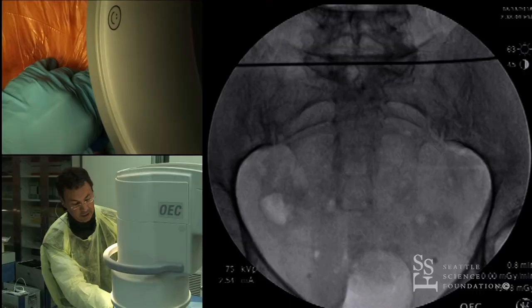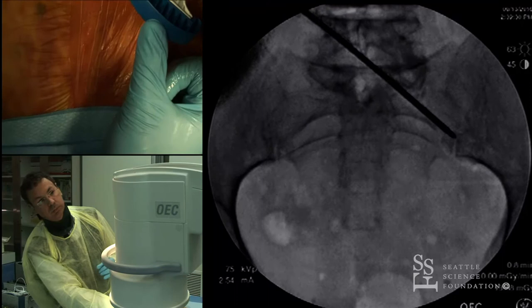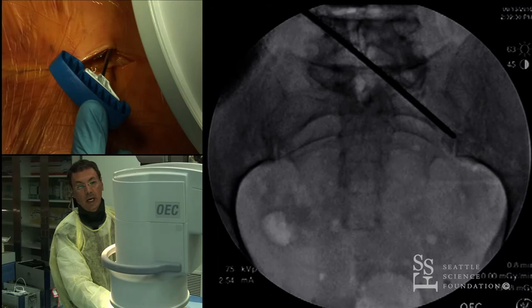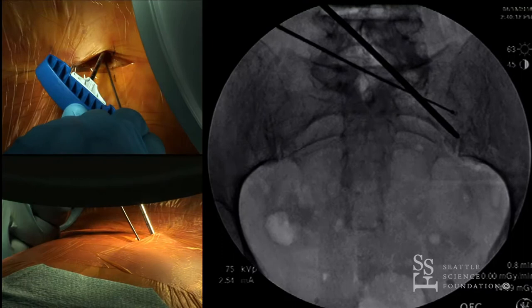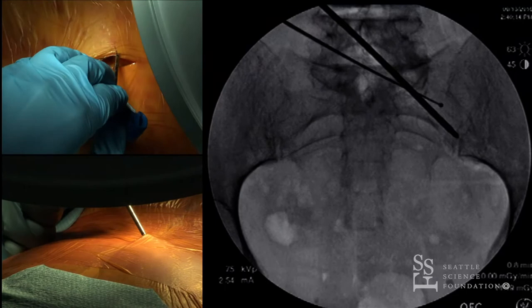You take a picture right there. Looking at the X-rays on the right, notice how low the entry point is compared to the other two techniques — very close to the pelvic brim, right at the SI joint. The S2 alar entry point would be approximately where the ball probe marker is. The key difference is that this entry point is actually in the joint itself.